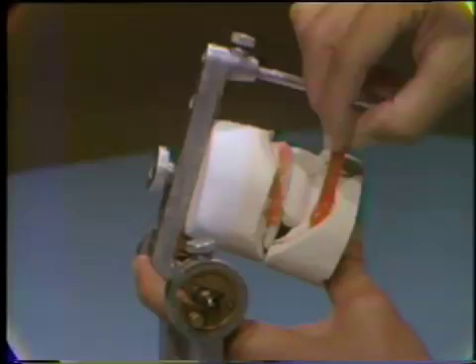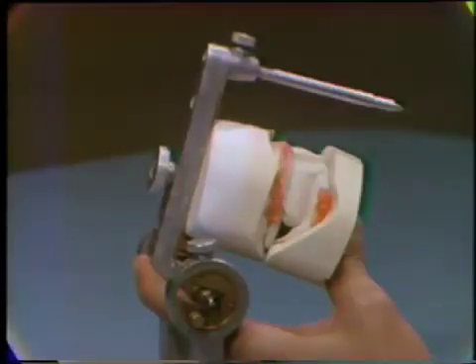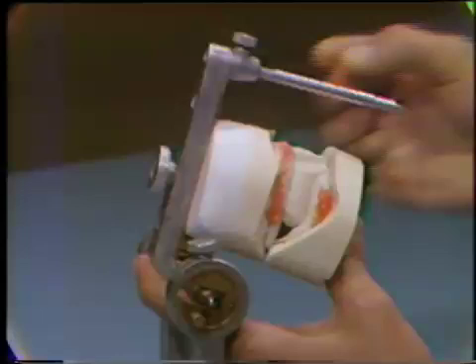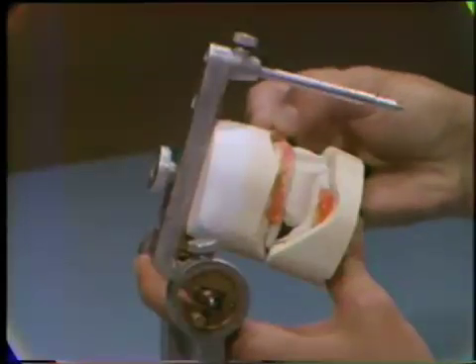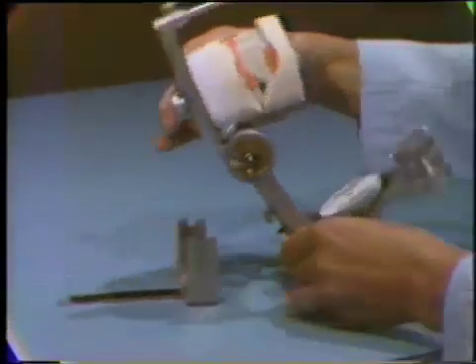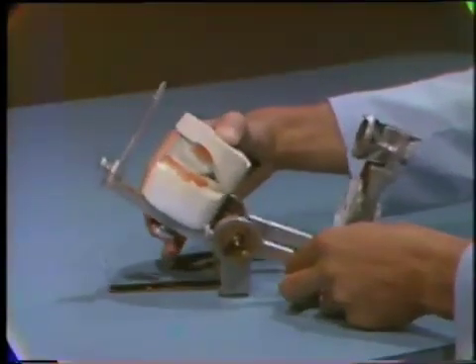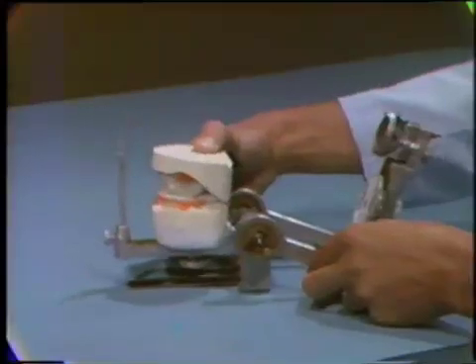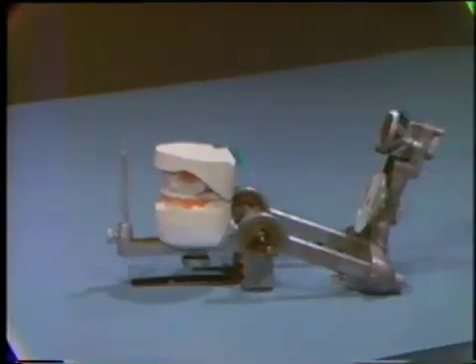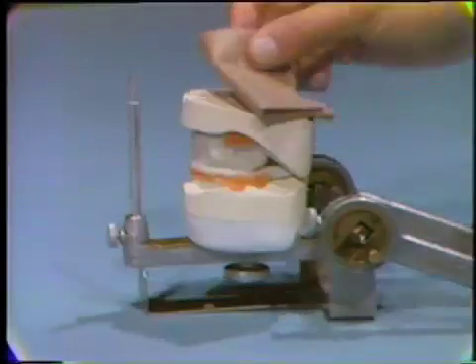Next, position the mandibular master cast in the mounting guide and secure with sticky wax. Place the articulator upside down in a mounting stand, and place a wet paper towel on the mandibular cast for about five minutes.